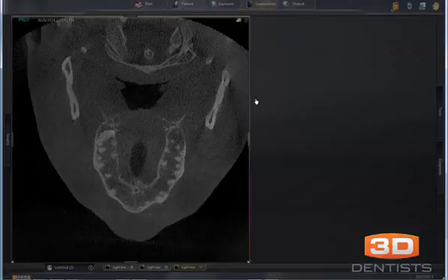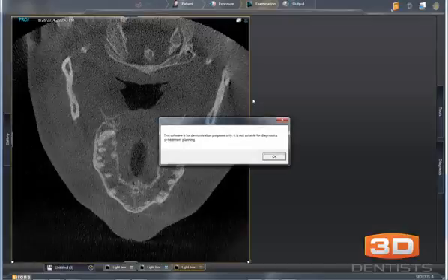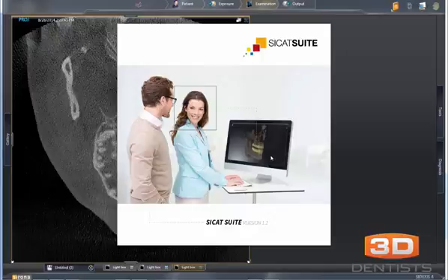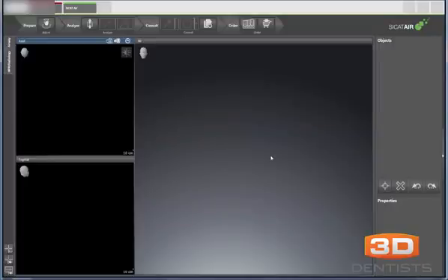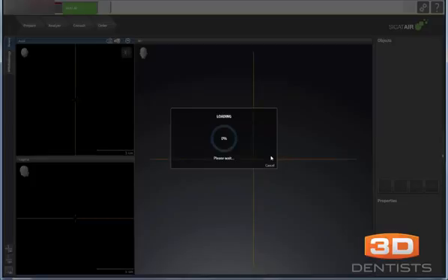Right now, since we don't have the official release, it's going to say this is demonstration only, but that pop-up won't show up in the future. Here we have our SiCAT Suite launching. The SiCAT Suite at this time is for Function, which is the jaw tracking and TMD software, and for SiCAT Air, which is the airway segmentation, which is what we'll be doing here.